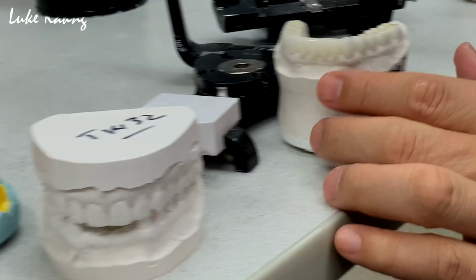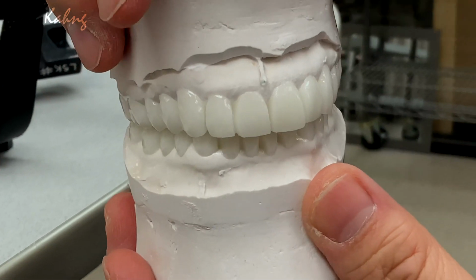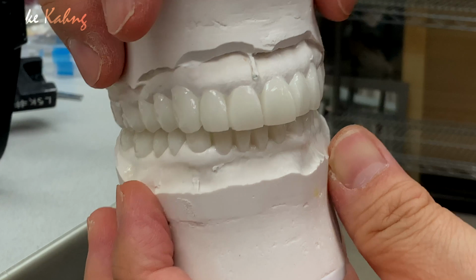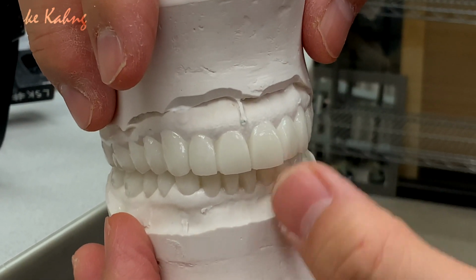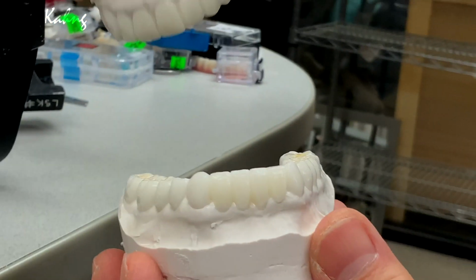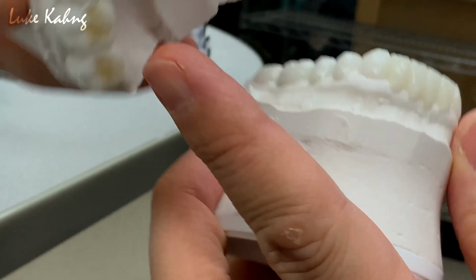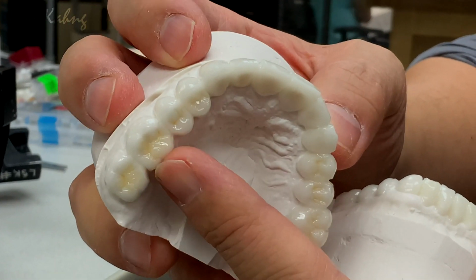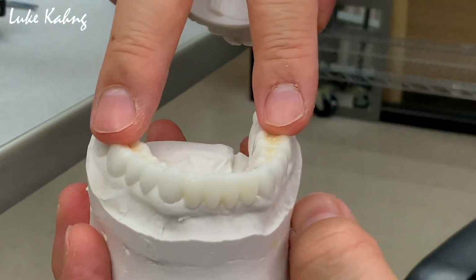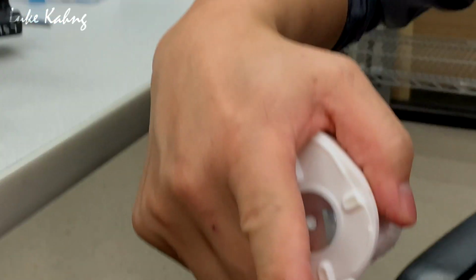Okay, so we got the 6 through 11. So now we're talking about the shape and contour. Basically, I follow the patient's tooth shape and contour, which is square and rounded, with a little step down. As you can see, in my final one, once I set up, I rebuilt the occlusion with the tooth morphology. So this is more important, which is lower. It's not upper.